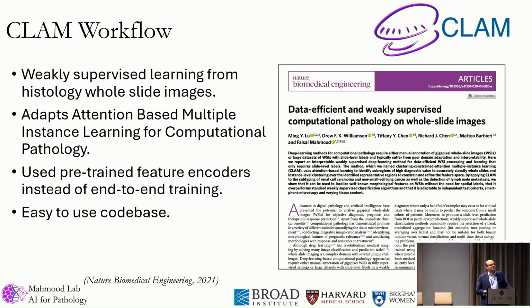Back in 2021, we did a study where we brought in attention, so making it attention-based multiple instance learning together with instance level clustering to make it a little bit more data efficient using some of the inherent hierarchy that lies in these images. And there's a lot of redundancy in these images as well. There's lots of normal tissue, repeating patterns, making use of those to see if we can make the setup a little bit more data efficient while using just the labels that we have in a clinical setting, so without requiring any pixel level annotations, just using these images and the labels that reside in the pathology report.